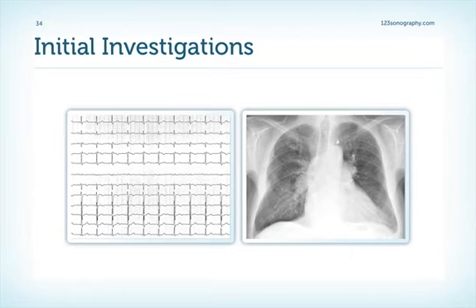Right ventricular hypertrophy on ECG is present in about 87% and right axis deviation in 79% of patients with idiopathic pulmonary arterial hypertension. Unfortunately, the absence of these findings does not exclude the presence of significant pulmonary hypertension, and so ECG is unfortunately an insufficient screening tool.